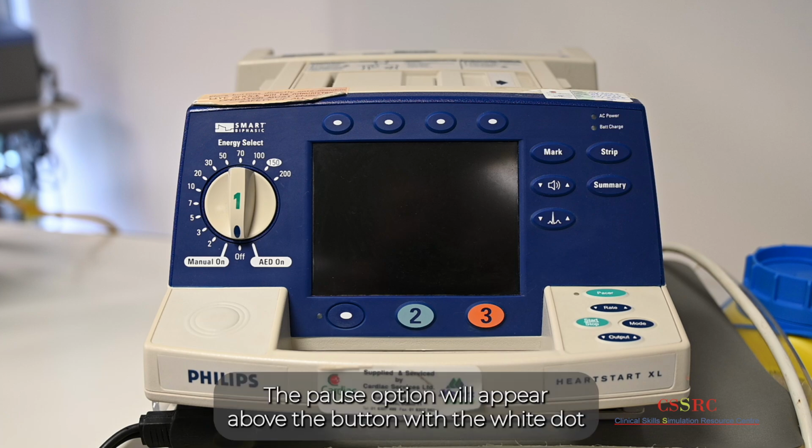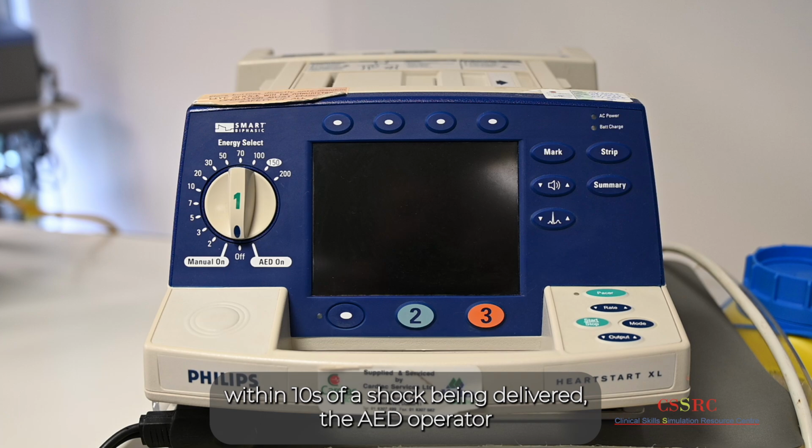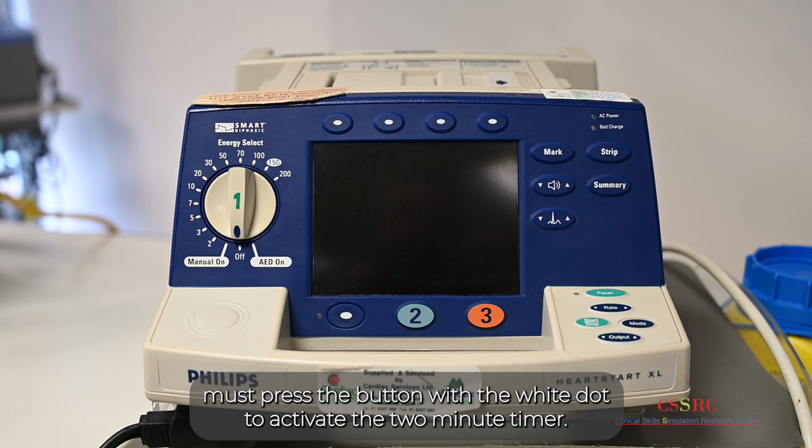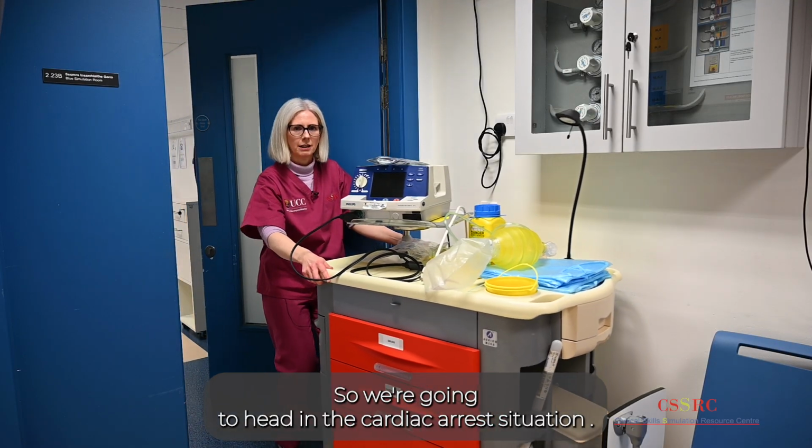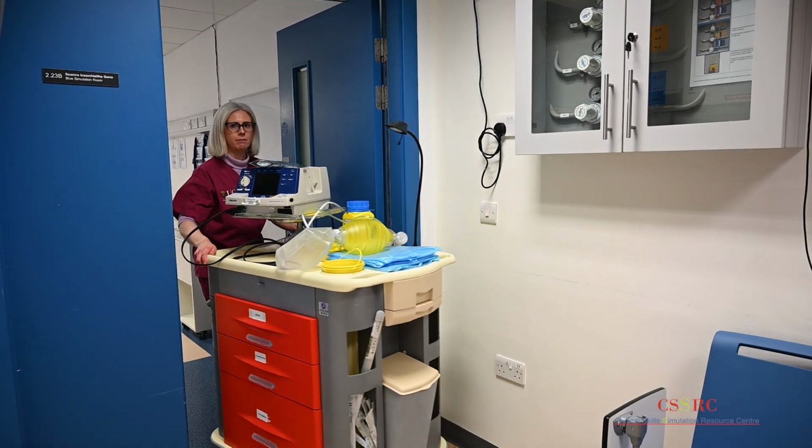The pause option will appear above the button with the white dot. Within 10 seconds of a shock being delivered, the AED operator must press the button with the white dot to activate the 2-minute timer.